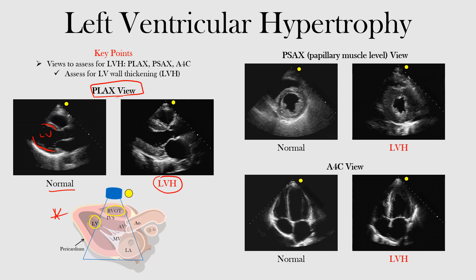This is our interventricular septum in this region. Notice in the picture that shows LVH, the wall has thickened quite a bit, and so has the interventricular septum. The LV cavity is now smaller. Notice the difference in size between them — that thickening of the left ventricle wall is what you want to look for.